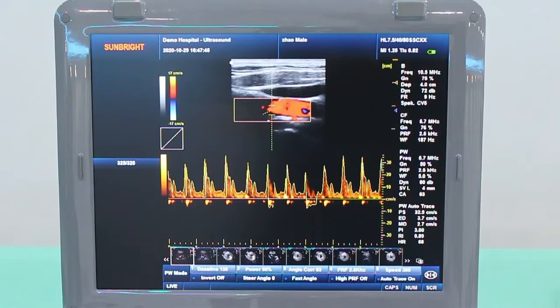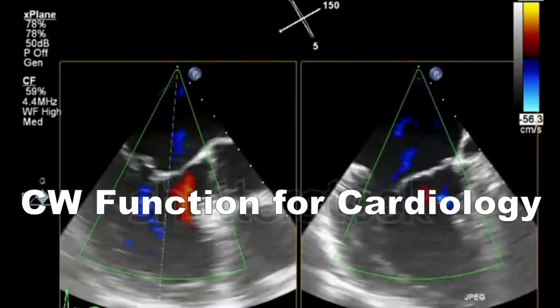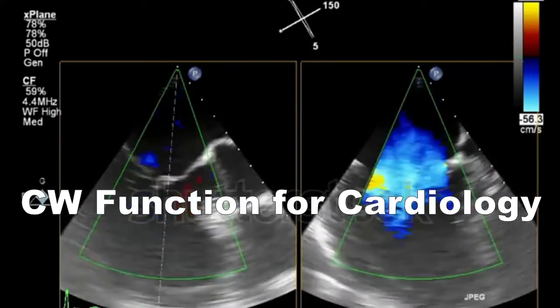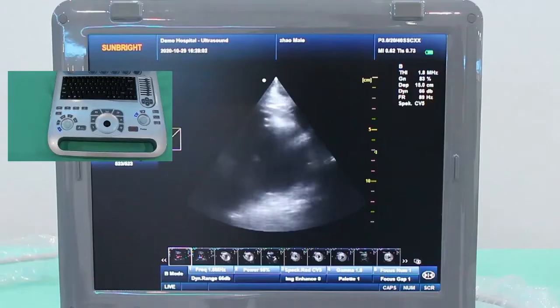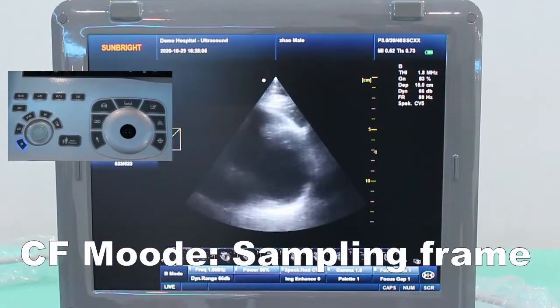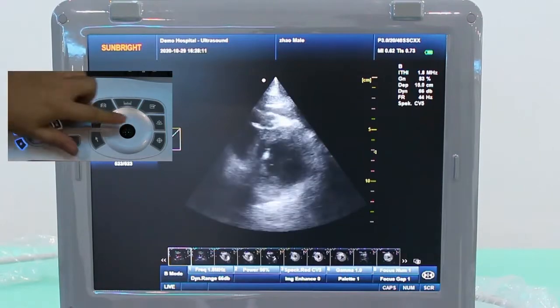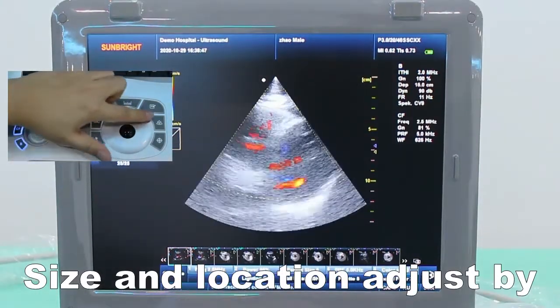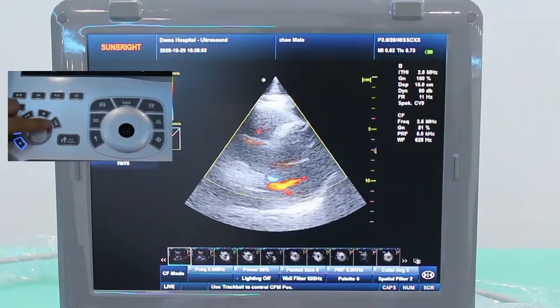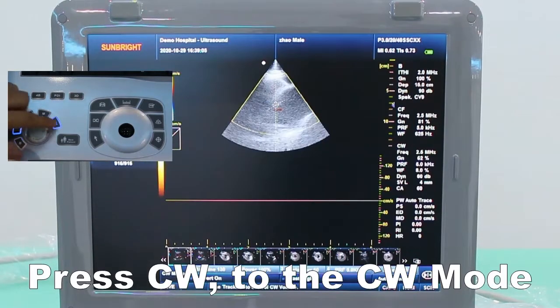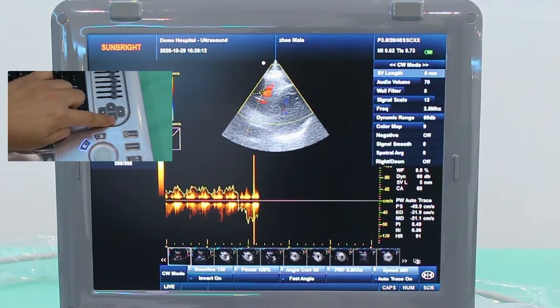CW function for cardiology. Procedures for CW function: First, make a scan of the heart. Then press CF. You can adjust the size of the sampling frame using the sample key and adjust the sampling location using the trackball. Press CW. You can adjust SV length.